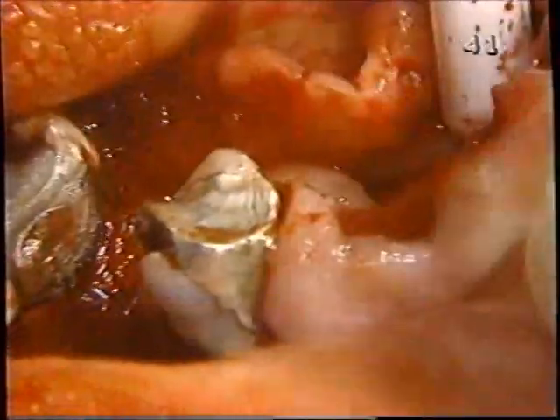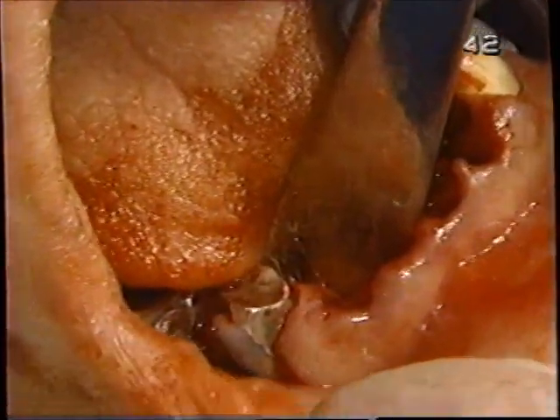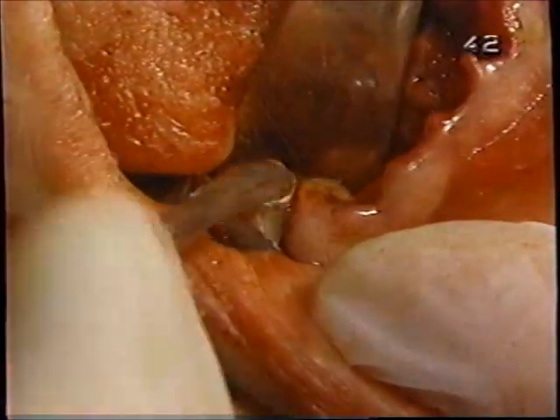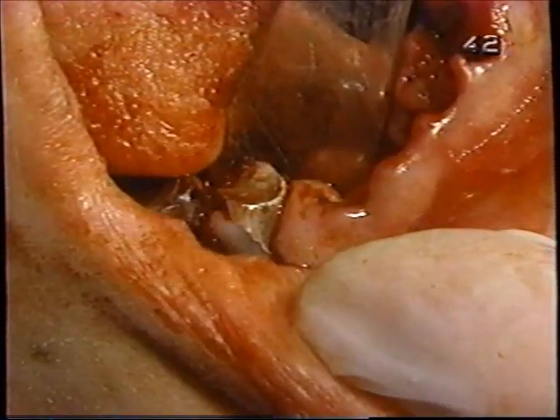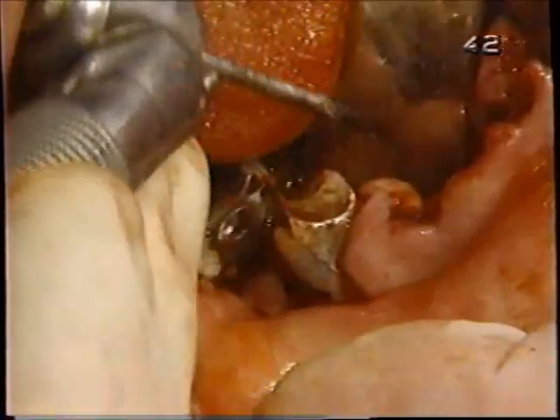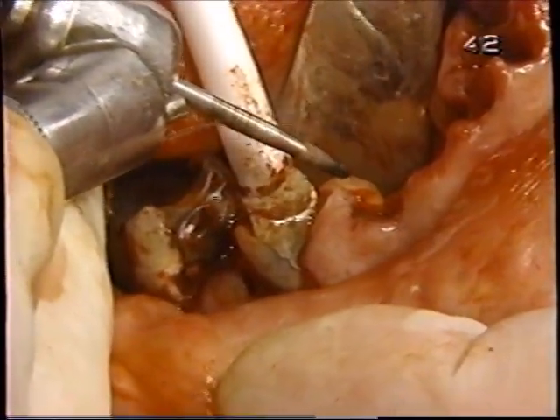If you do have to reflect below the floor of the mouth, it opens up the possibility of contaminating spaces. We can see a very prominent torus here. Since this patient is going to have a partial denture, it would be very appropriate to relieve that. To not do so would make denture fabrication extremely difficult. Rather than shaving it off altogether, we'll just start off right at the normal contour that we would like.